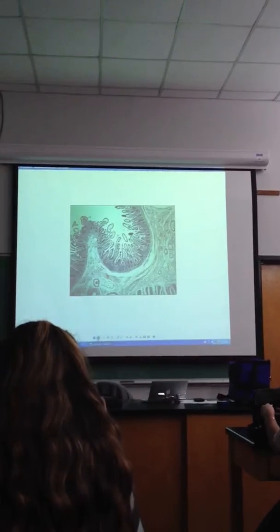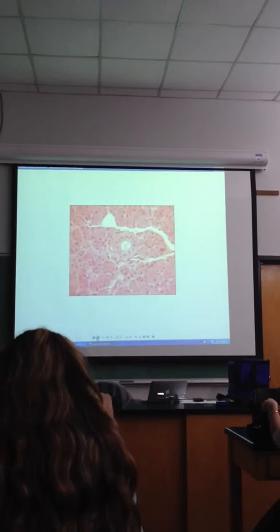You said B and T cells? That's in the area. Collection of B and T cells.